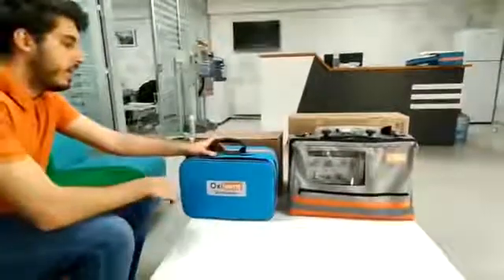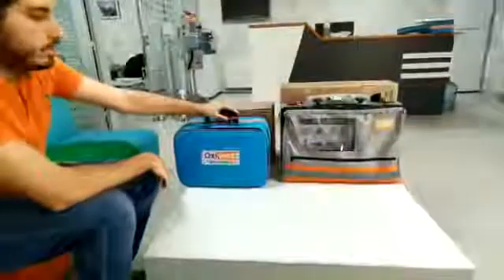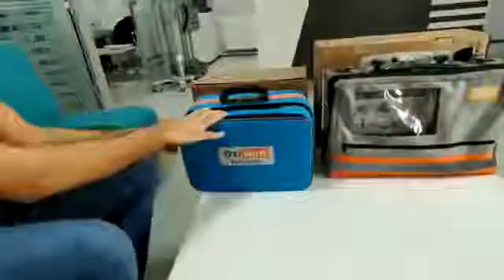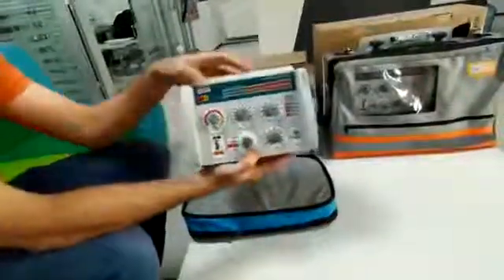Hi, I'm gonna show you OxyVent Life Transport Ventilator. This is our standard packet. This is our OxyVent Life Transport Ventilator.